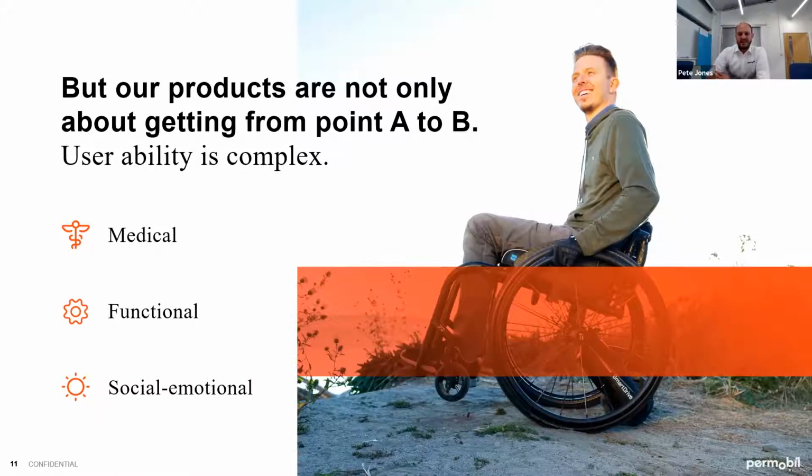Spinal cord injuries, average age is 43 years old for diagnosis, and you could be in a wheelchair for 20 to 25 years. MS, mean age around about 50 years, 10 to 15 years in the chair. And then lastly, ALS, average age is 55 years, time in a wheelchair is 1 to 2 years, which is a sad statistic.